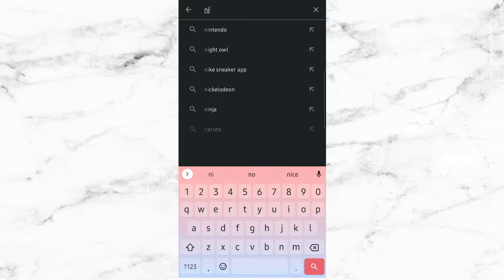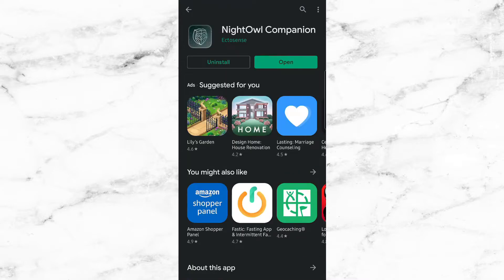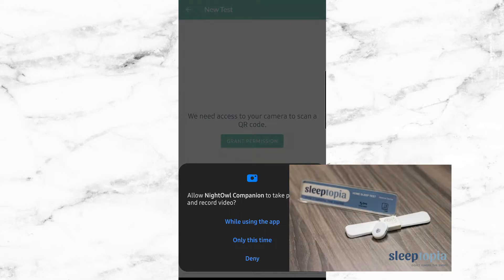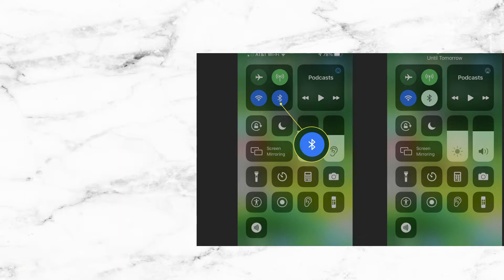Now we're going to show you how to set up the device. All you're going to need is your smartphone. If you have an Apple device, you're going to want the App Store. If you have Android, you're going to want to go to the Play Store. Next, search for the Night Owl companion app and press the install button. Once the app successfully downloads, open up the app and click on 'I have an activation code.' After that, scan the QR code that Night Owl sent you via email. You can also type the code in manually if you wish. Make sure to turn on Bluetooth so the Night Owl device can connect properly to your smartphone.